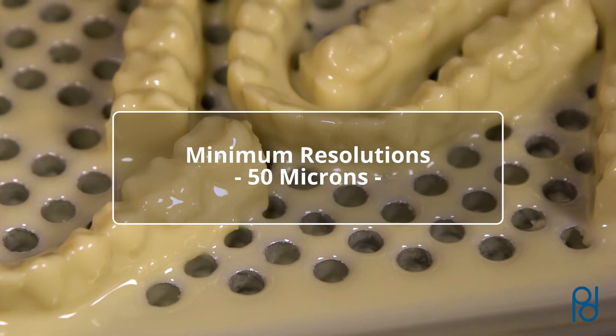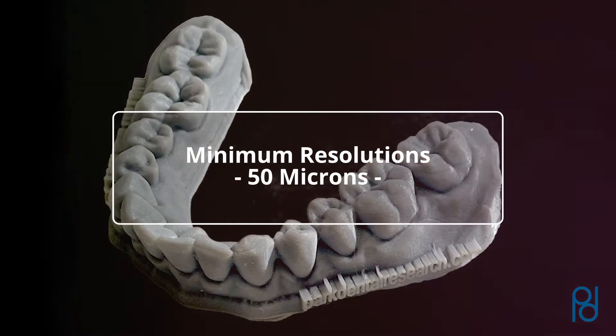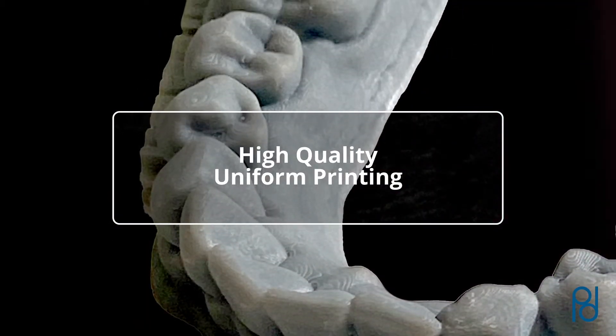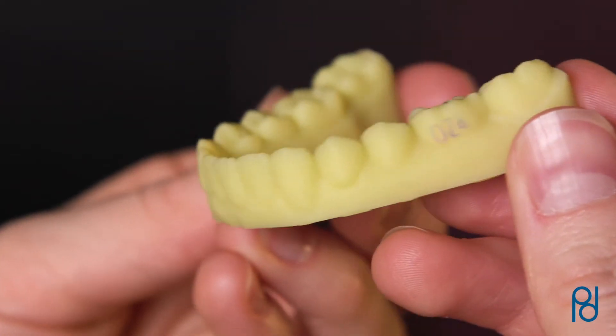With minimum resolutions of 50 microns, the JUUL 3D3 printer produces high-quality, uniform printing across the entire build area, resulting in smooth and precise models.